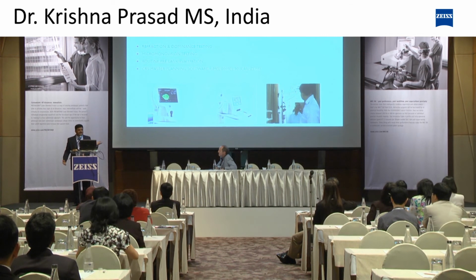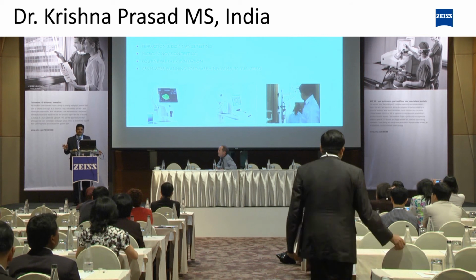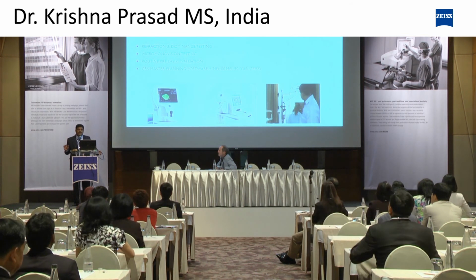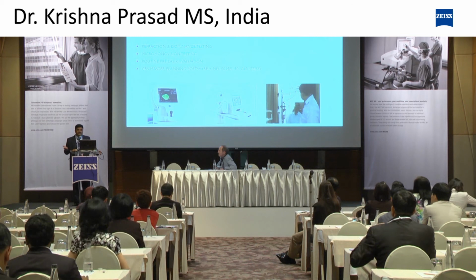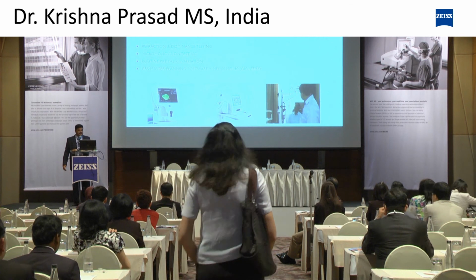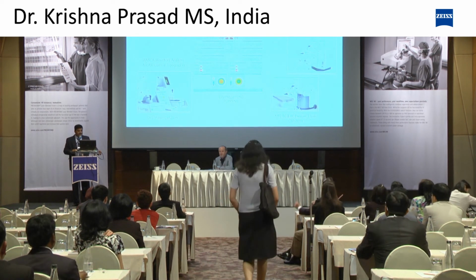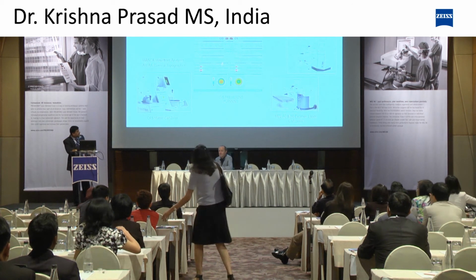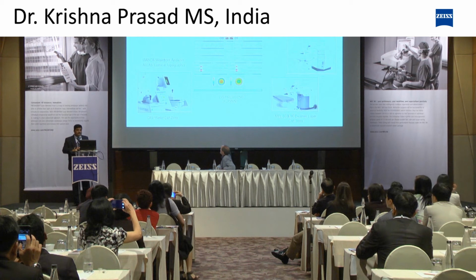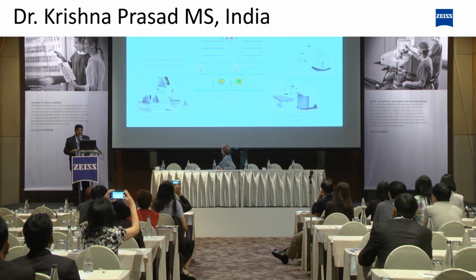The treatment is routine LASIK, with the routine pre-LASIK evaluation, and with the help of special software, CRS Master, using either MEL 80 or MEL 90. Normally the software works with 1.5 diopters, but we have been doing it for patients from 37 years to 52 years.